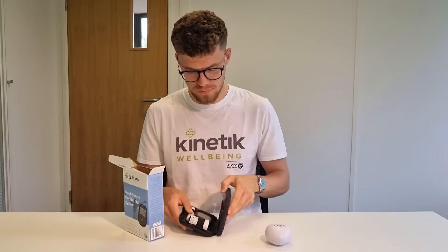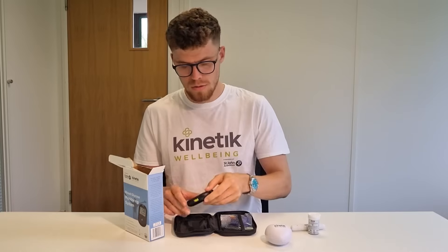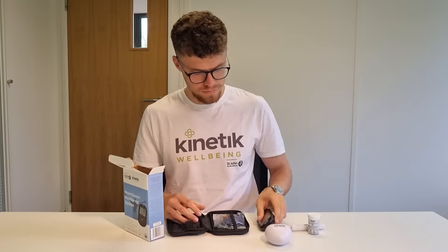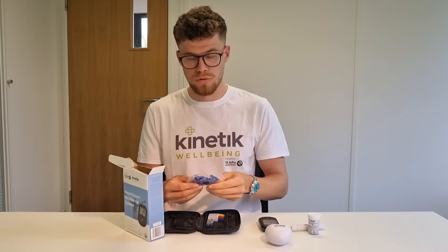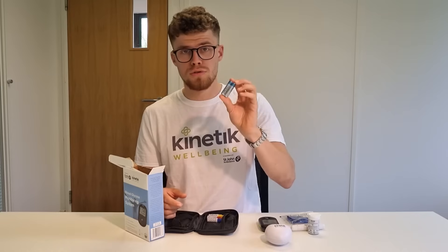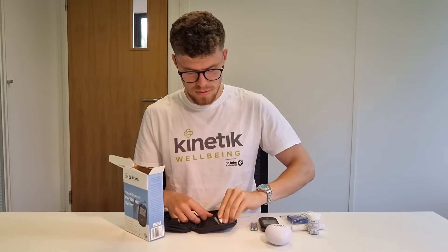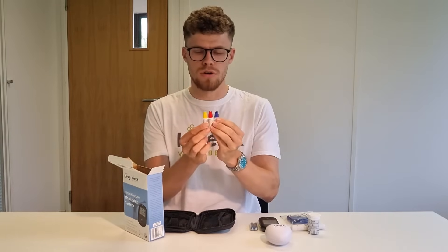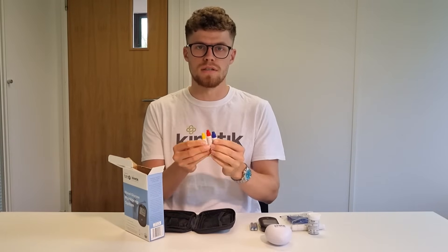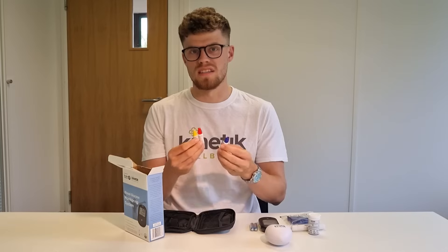Inside the travel pouch we've got test strips, a lancing device, the meter itself, lancets for the lancing device, two AAA batteries, and three bottles of control solution so you can test that your meter is giving you the correct readings. Each one has a different amount of glucose in it so you can test that your machine is accurate.